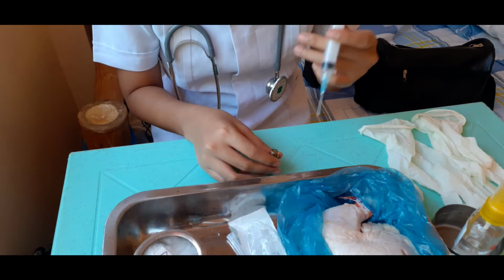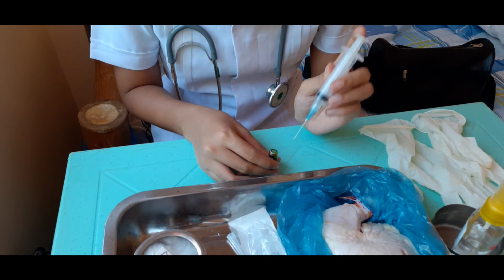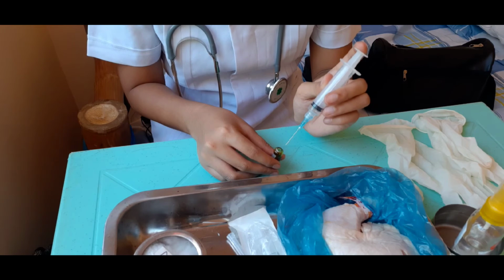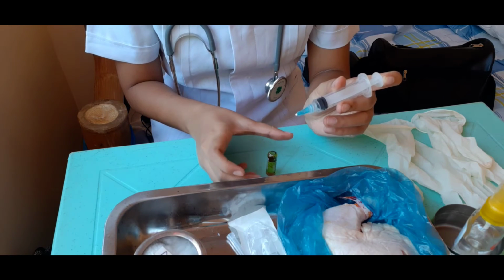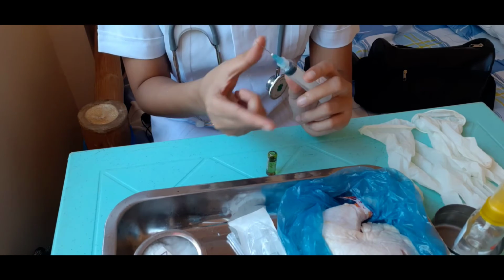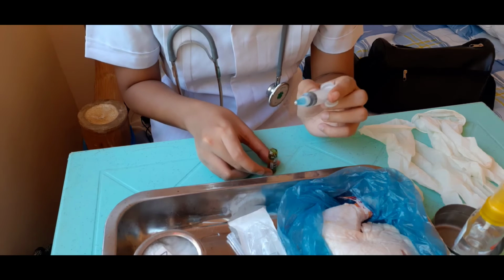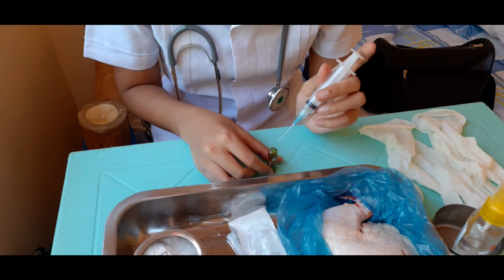And then I am now going to withdraw. With a single-dose ampule, we are going to hold the ampule slightly on each side. It is necessary to obtain more than the ordered amount of the medication. Then dispose of the filter needle by placing it in a sharp container after that. For example, we are going to assume that we have a filter needle. I am done preparing the filter needle. After that, I'm going to dispose of it in the sharp container, like I disposed of the neck of the ampule of our paracetamol. Then next, we are now going to give the injection, replacing the filter needle.